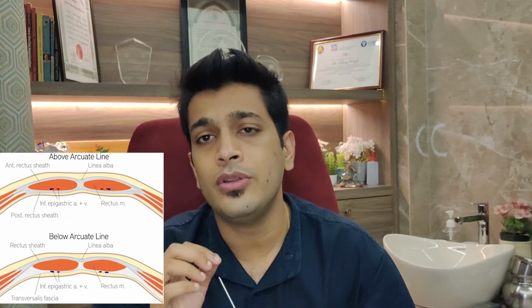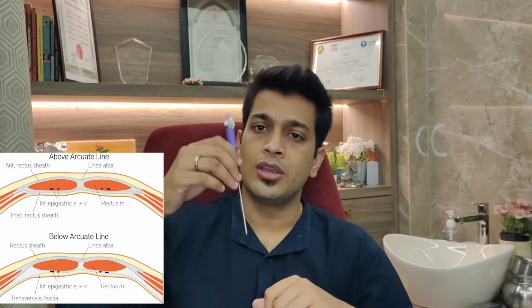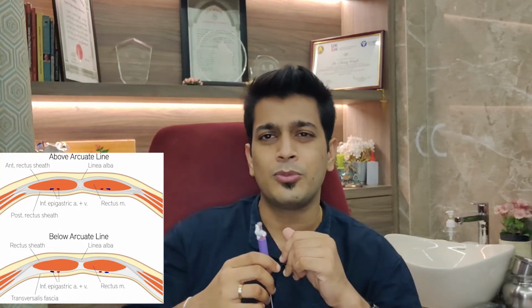Now, when you're entering, you will be hearing a few clicks. So just place the Veress perpendicular, take a stab incision, place it perpendicular and hear your clicks as you pass the layers. You'll get 2 or 3 clicks typically, mostly 2 clicks, and as soon as you feel the loss of resistance, you stop. Don't unnecessarily push the Veress in too deep after you have lost the resistance, because the next click that you get after that would be the retroperitoneum and the major vessels, so that should not be done. Once you get the 2 clicks, you have to do the tests.